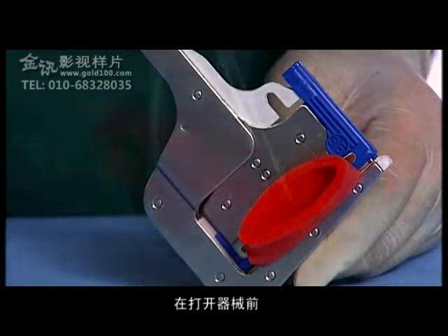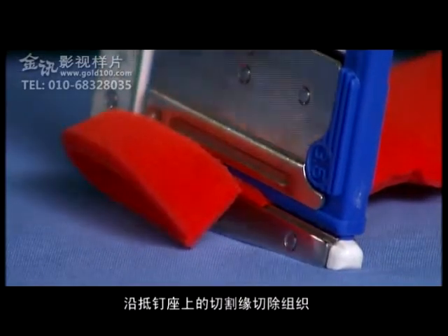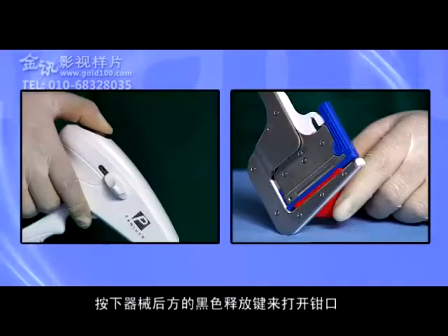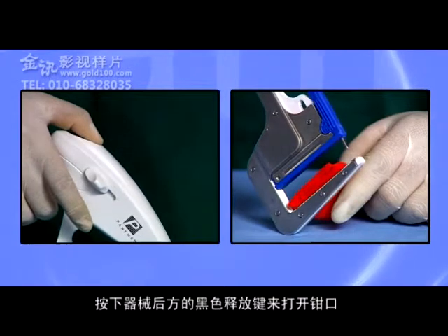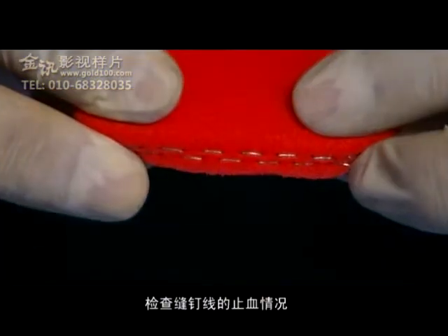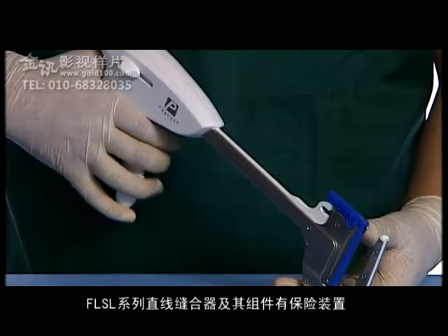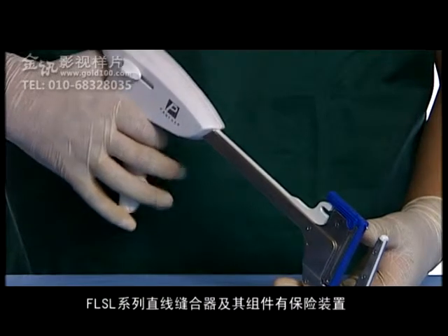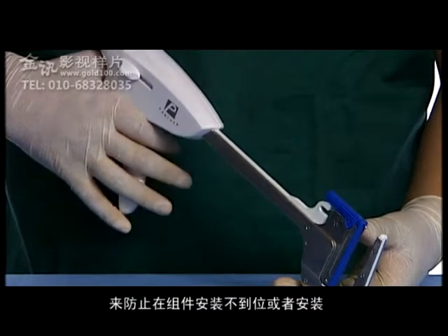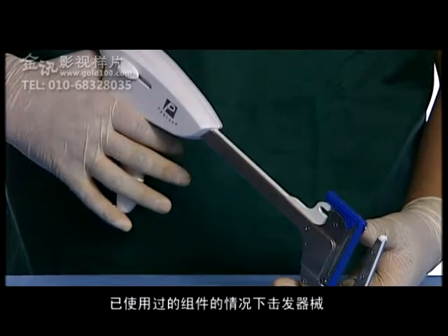Prior to opening the instrument, the cutting guide built into the anvil may be used to transect the tissue. Press the black release button in the rear of the instrument to open the jaws and unlock the handle. Check the staple line for proper hemostasis. The FL-SL series of linear staplers and reloading units are equipped with a safety lockout that prevents the instrument from being fired with a used reloading unit or with an improperly placed reloading unit.